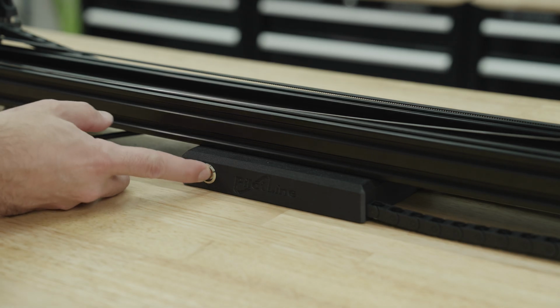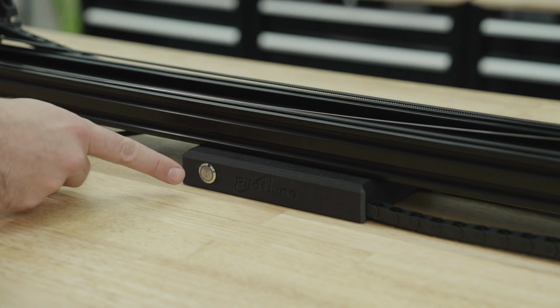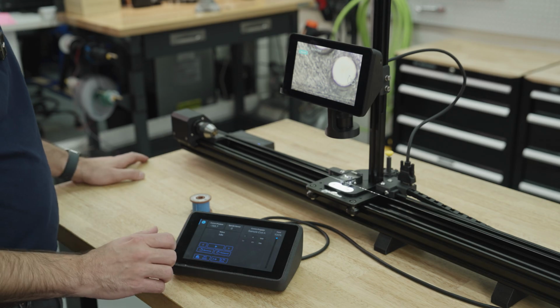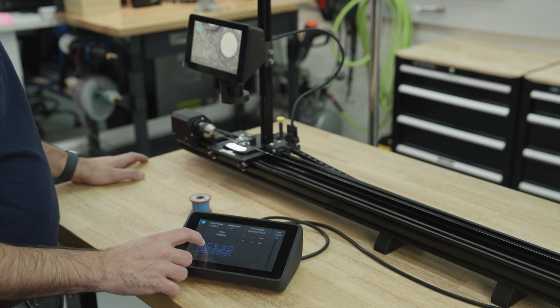To power on the machine, just press the power button. A flashing green light lets you know the machine is booting. Once you see a steady light, you're ready to go. Now let's jog the carriage close to the spindle. Use the arrow keys on the screen to move it.